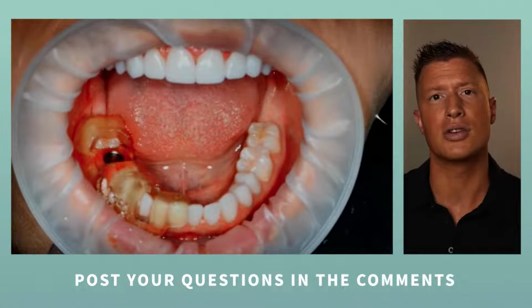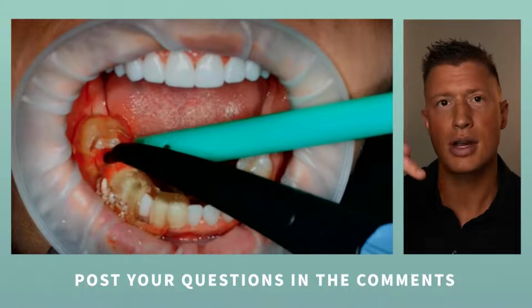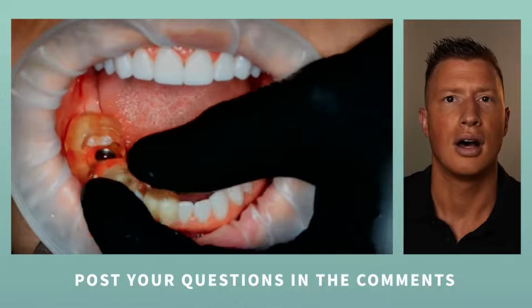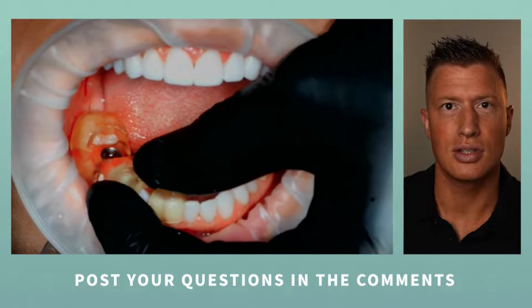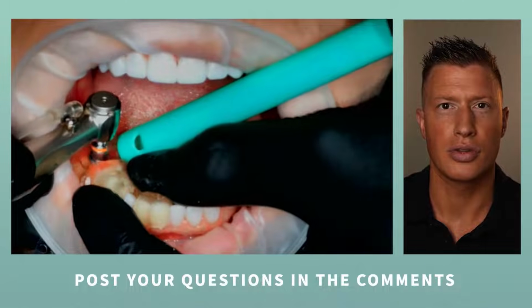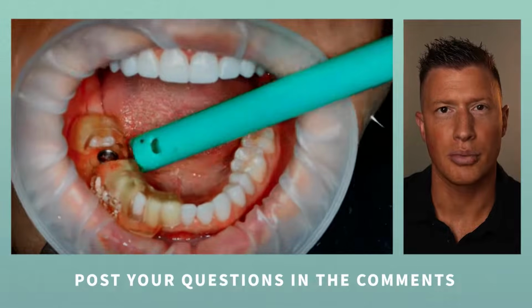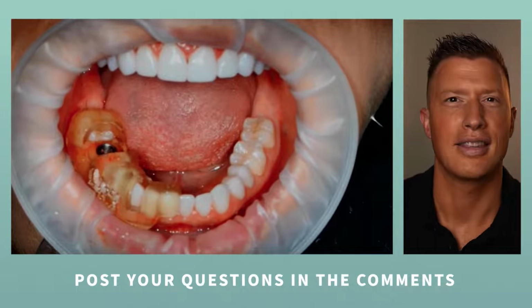That's one thing I love about Dytron and the way they ship this: the implant is going to come out of a sterile environment and go right into a sterile holster, the stainless steel holster that it came in. And then we're going to make that site just a little bit larger. And see, I'll go in here with a little larger drill, same thing. And then we'll go back with the implant after I feel like, hey, I've given it just enough more room to get that implant in place.